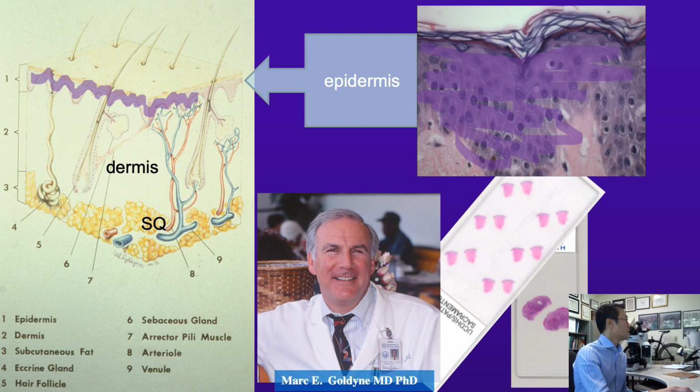So this is the epidermis, and it contains mostly keratinocytes, but also melanocytes, Langerhans cells, Merkel cells, occasional small trafficking lymphocytes, but we'll focus on the keratinocytes and the melanocytes for now. And we're not actually going to discuss much about the underlying dermis or the subcutis, but we can see that the vascular lymphatic system, hair follicles, sebaceous glands, eccrine, and in some sites, apocrine, sweat glands, and ducts are present, and then an underlying subcutaneous fat layer.